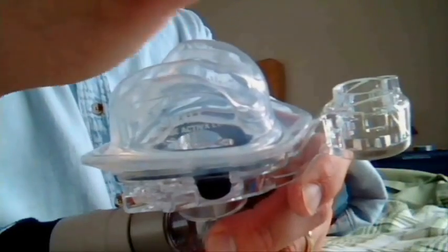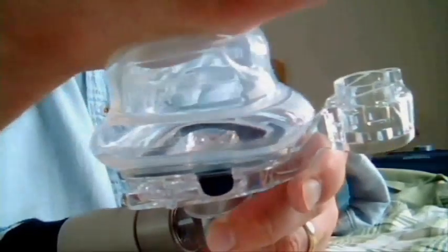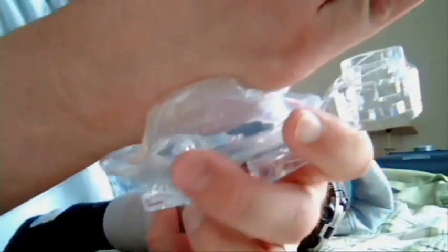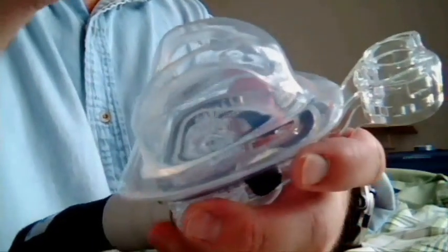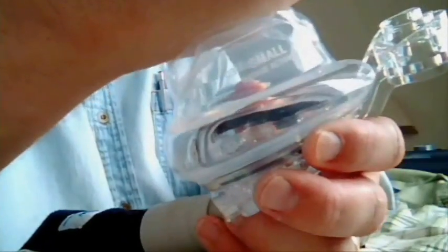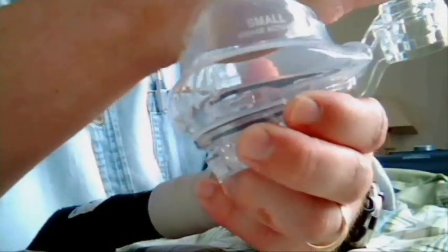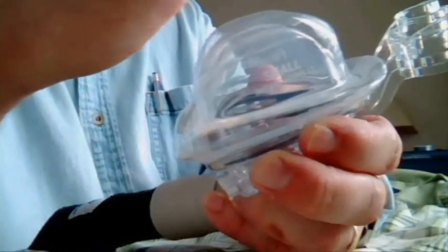Here we go. This is the Mirage Activa LT and you can see the air is already on — I did turn it up to 20cm. See how it just jumps out and grabs my hand. Now I'm working it back and forth, top to bottom, up and down, in and out. I'll go side to side. There's an accordion-style section in there. Look at this thing move. This is Activa for a reason, and this right here is the mask I personally own — it's my number one favorite right now.